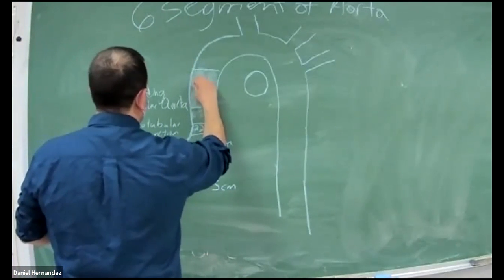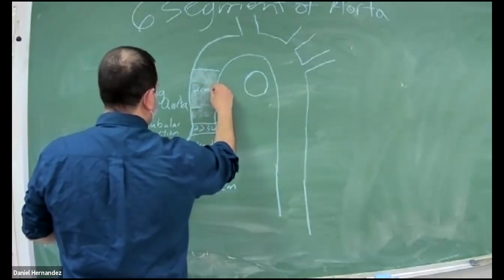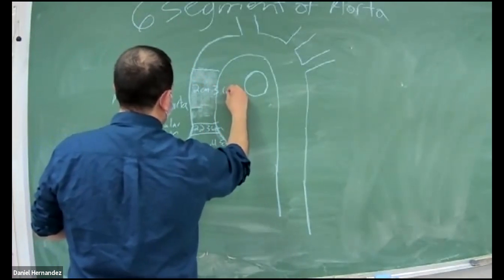This has a diameter of 2 centimeters to 3.6.